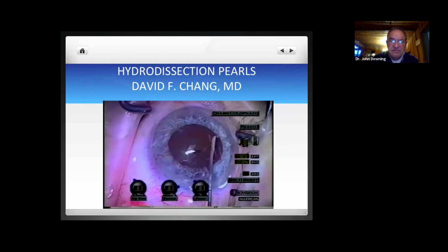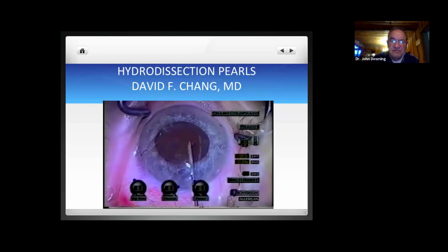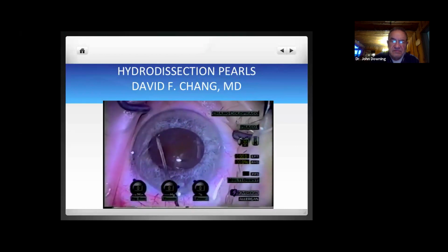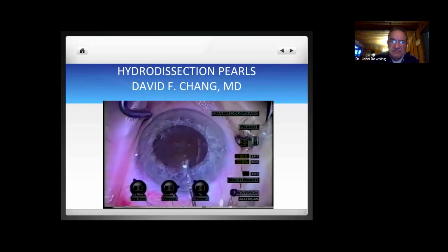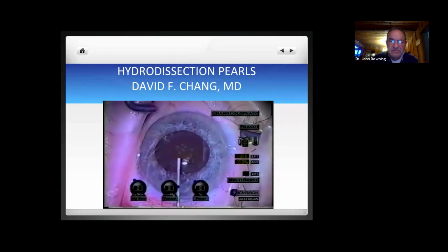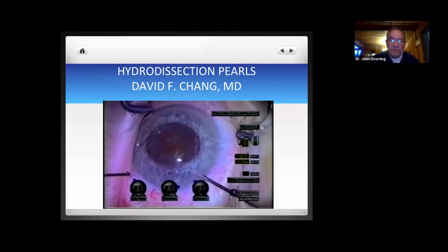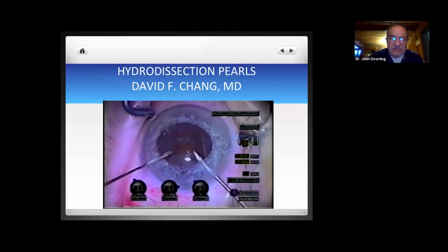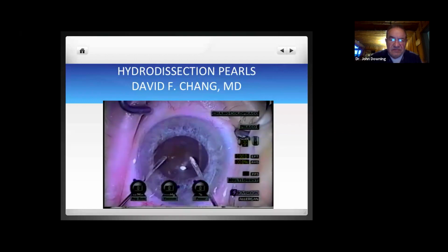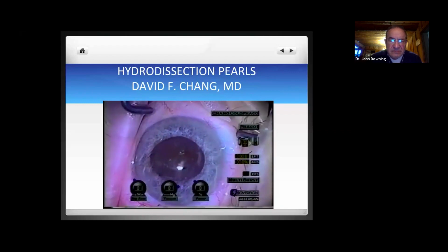Now here, because of the laxity of the zonules, our normal steps do not cause a good rotation. In fact, we see displacement laterally of the nucleus. If this occurs, it's because we don't have enough circumferential zonular tension to anchor the capsular bag, which wants to turn along with the nucleus. So here it's best not to persist and be overly aggressive, and instead we're going to use a Lester hook and our capsulotomy needle to create a 2-point fixation to revolve the lens, thereby loosening it in the bag under viscoelastic before starting the case.